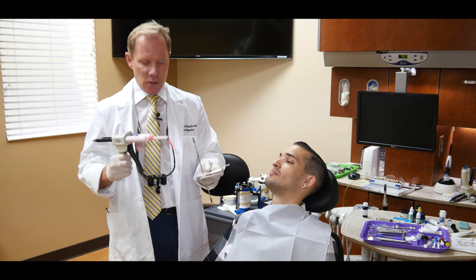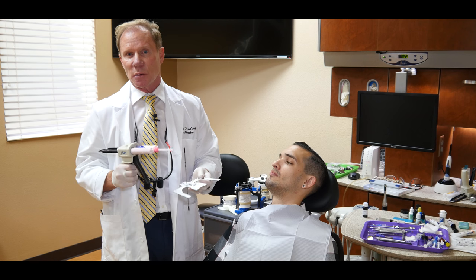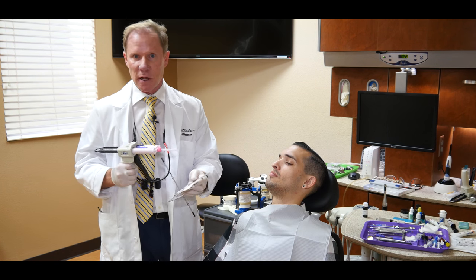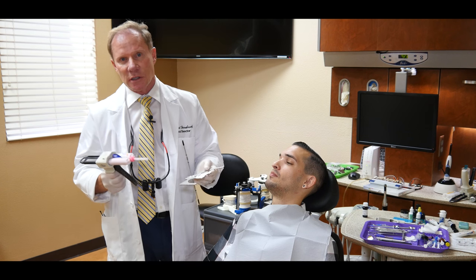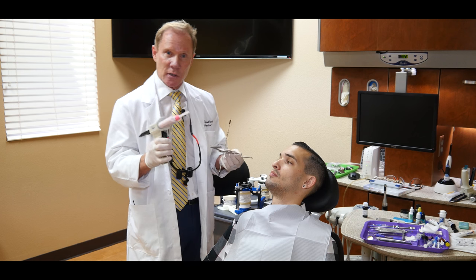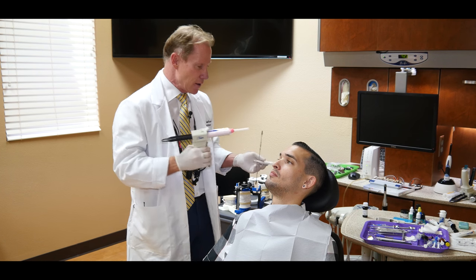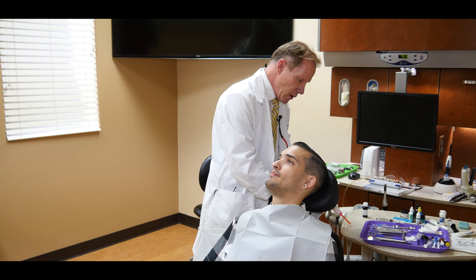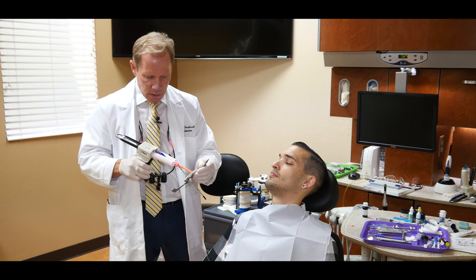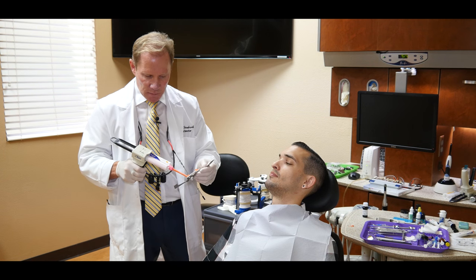Some clinicians use little plastic tabs available from Panadent that you actually stick to the plate, put in a hot water bath, wait till it's soft, and then you put it in place. I prefer a bite registration material because it sets up very, very fast. So we're going to go ahead and inject just a little bit. We don't need much, on the posterior of the plate.